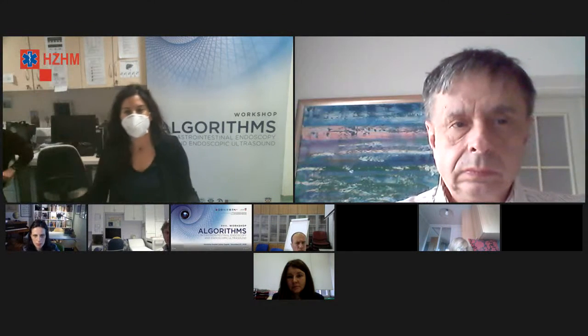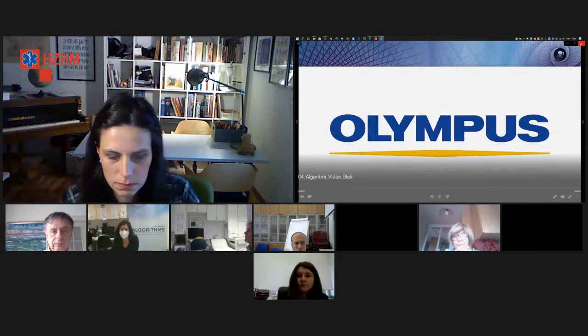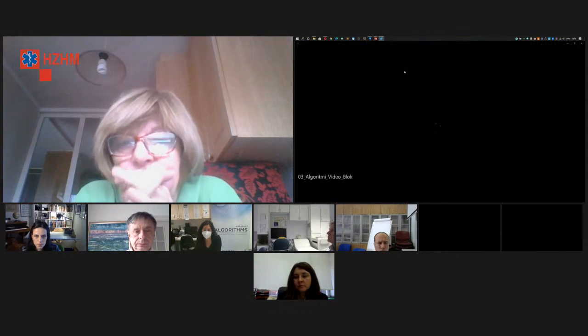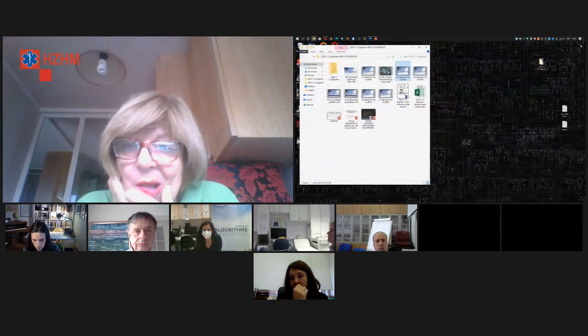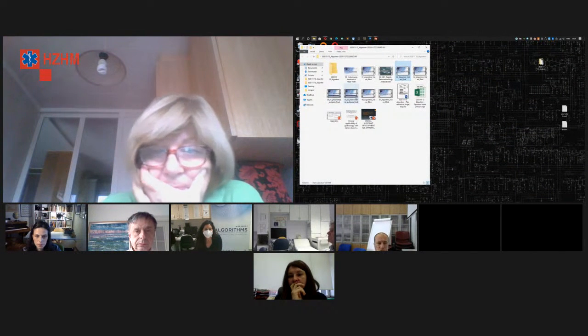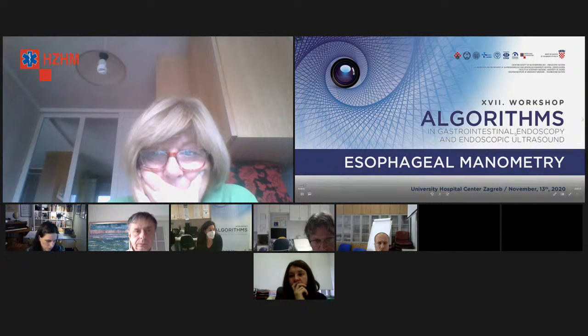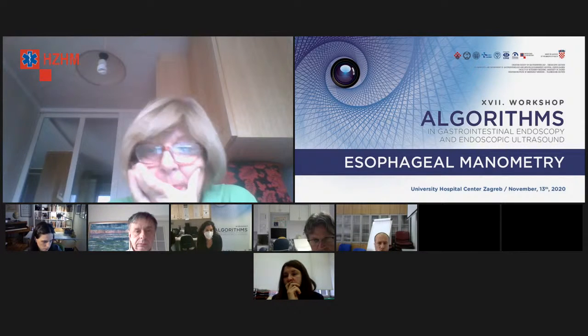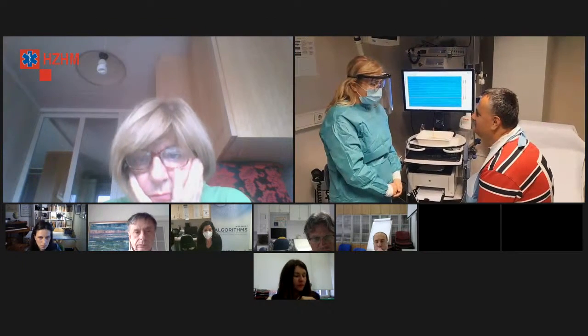Evo, sad će nam kolegica Maša zapravo prikazati. Kateter se uvodi kroz nos, izaziva se iritacija oka, kratka nelagoda dok treba progutati sondu.